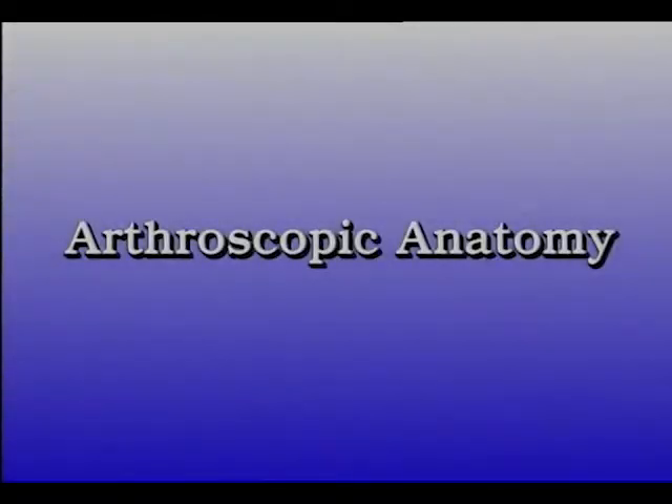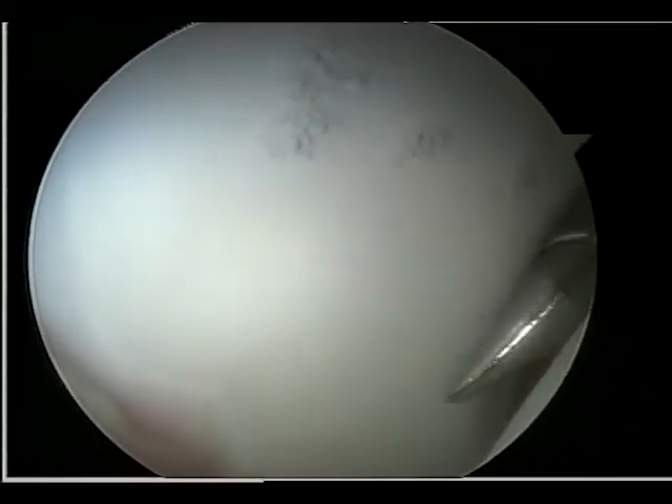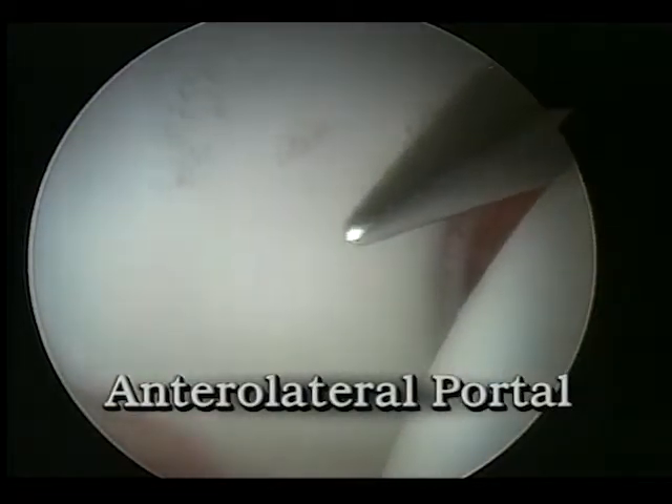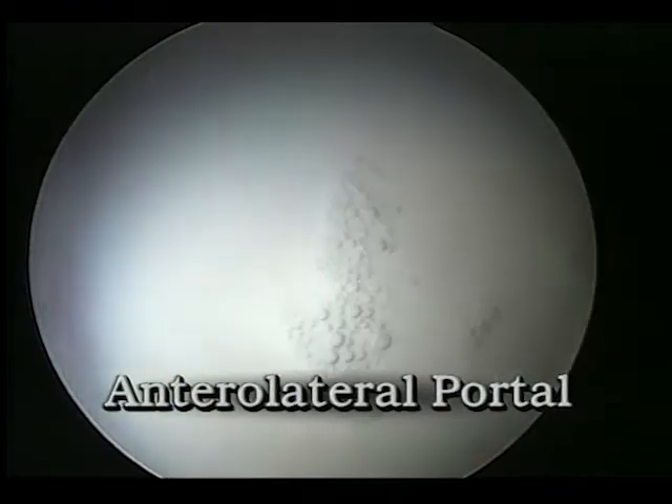Arthroscopy allows reliable inspection of many portions of the joint. Examination begins from the anterior lateral portal as it is the first portal established. Entering the lateral capsule over the anterior border of the greater trochanter, the structures that are best visualized from this area include the anterior acetabular wall and the anterior labrum.